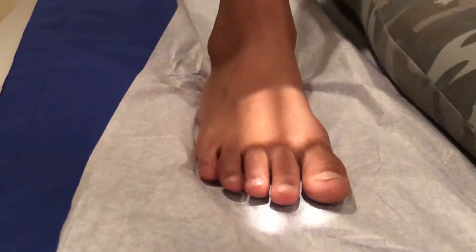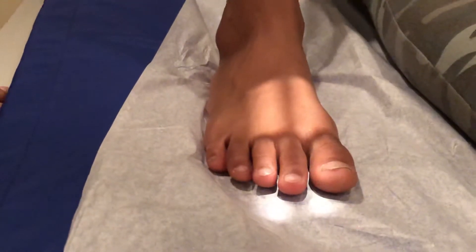Hi, you clicked on this link because you want to know how to take an x-ray of the second toe, and I'm going to show you how to do it perfectly every time.